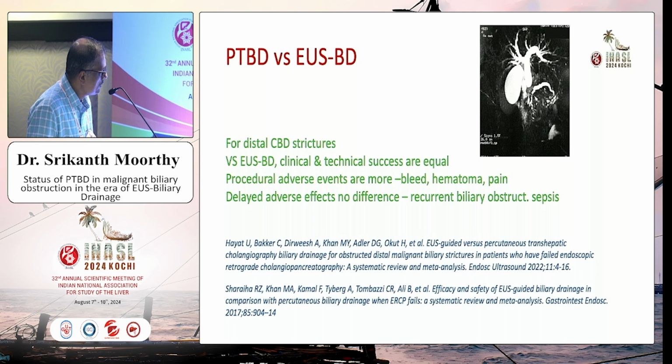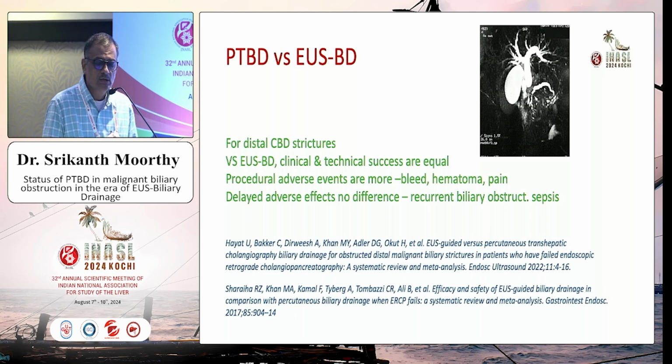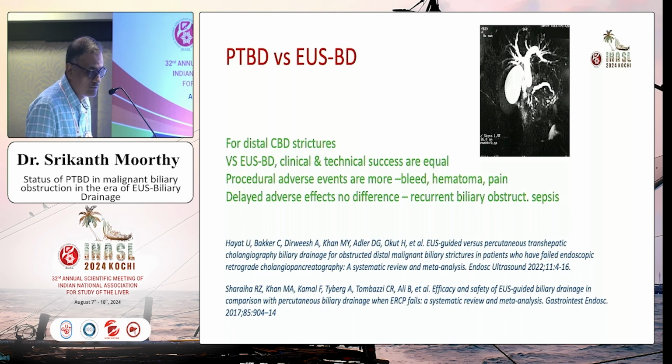So overall, you see that it's very positive for EUS BD, and plus one great advantage is that if you want to switch from ERCP to EUS BD, you just do it on the same table. You just take out the scope, put in another one, and you can do it. On the other hand, PTBD means going to another department. It's a different setting altogether.